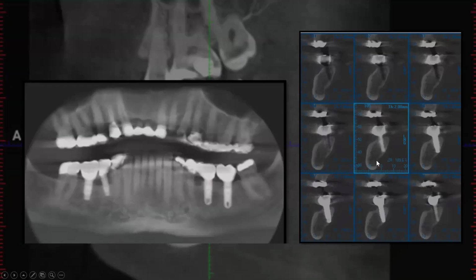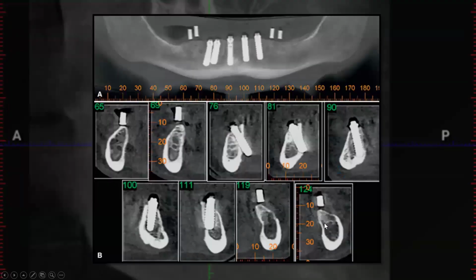And now we see in 3D, what's that structure right there? That's one of your anatomical structures. It usually shows up as just a big radiolucent area in the posterior mandible. That's your submandibular fossa. And so this one was okay. They just kind of went into that cortex. Maybe they perforated a little bit. But there are cases like this, where in the panoramic view, it can look like everything's fine. It's within the bone. But looking at the angle of the implant placement, they really went out the lingual cortex here.